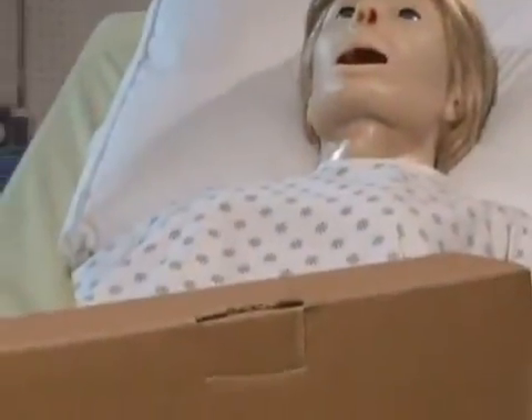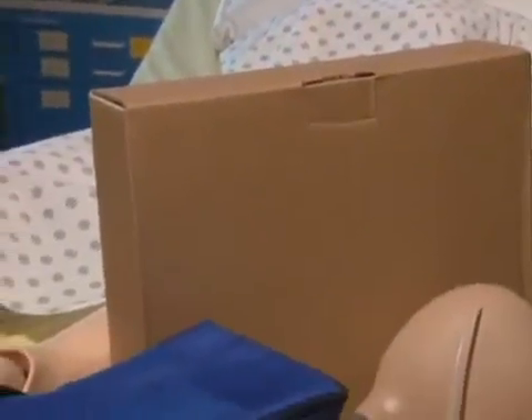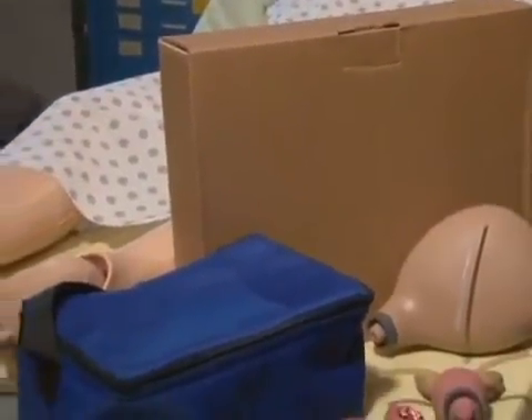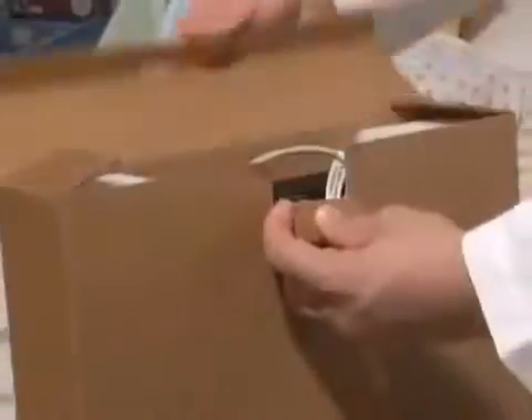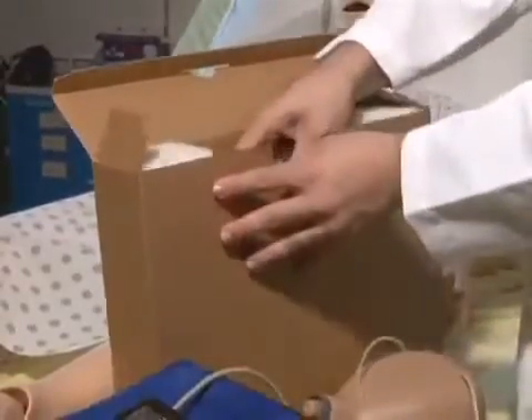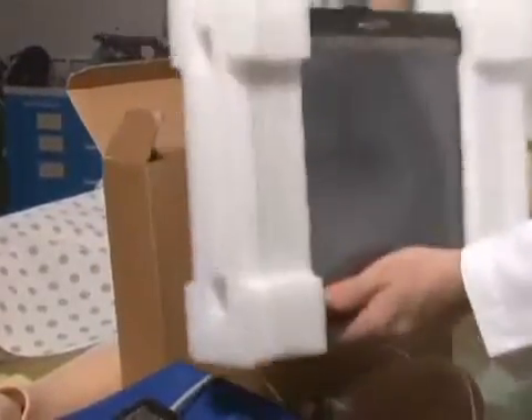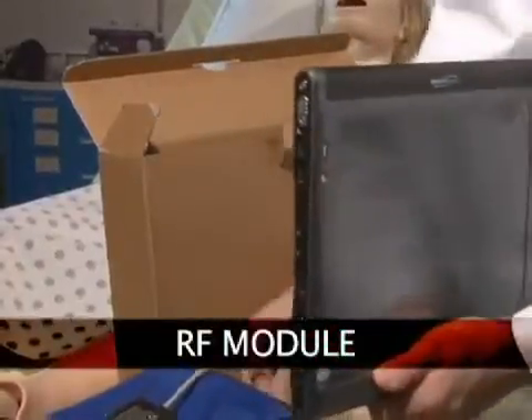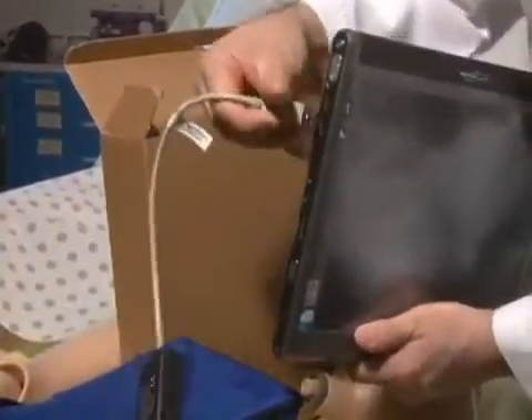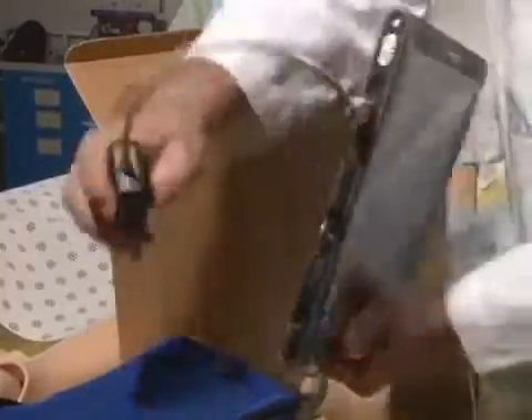The first task following the arrival of your new Susie simulator is to ensure you have received all the equipment and accessories. Remove the tablet computer which is packaged separately and connect the RF module to either one of the USB ports on the left side of the tablet.